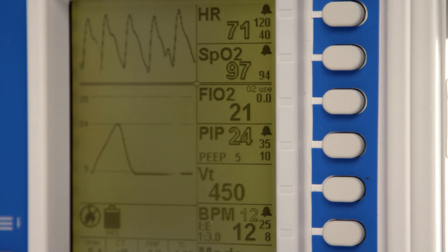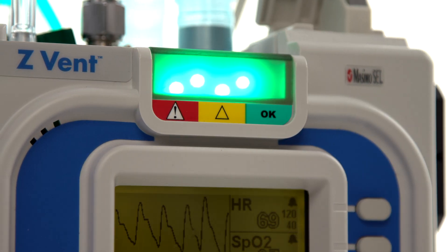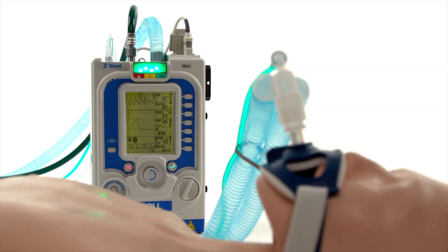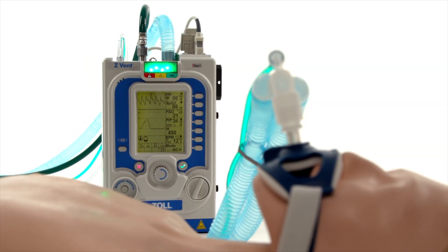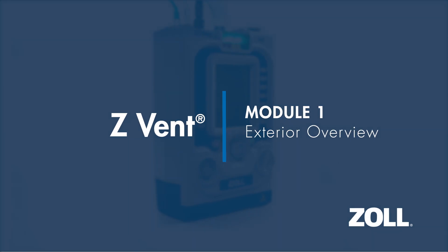Hello and welcome to the ZOL Z-VENT in-service demonstration. This multiple part series will provide detailed information about the Z-VENT Portable Critical Care Ventilator and its functionality. In this module, we will review the exterior of the ventilator.